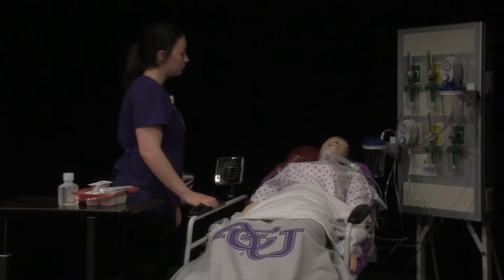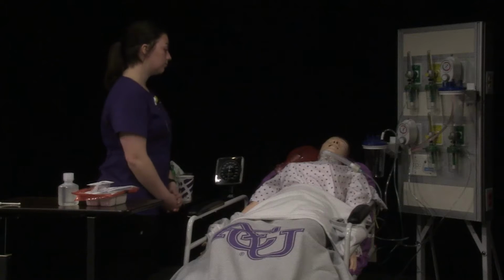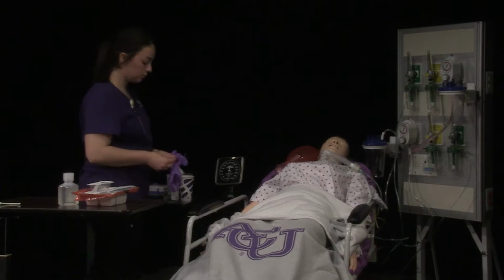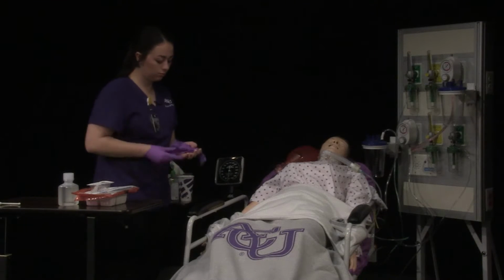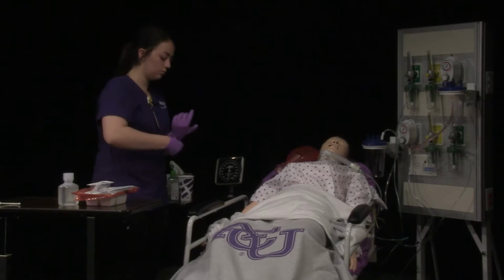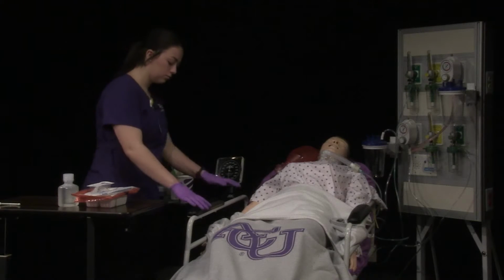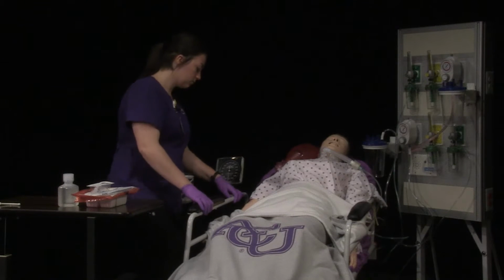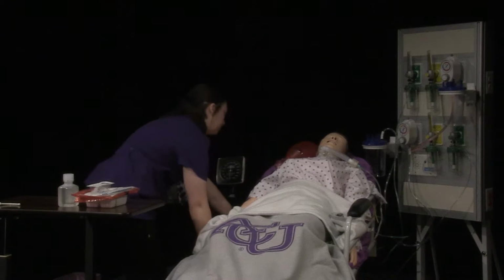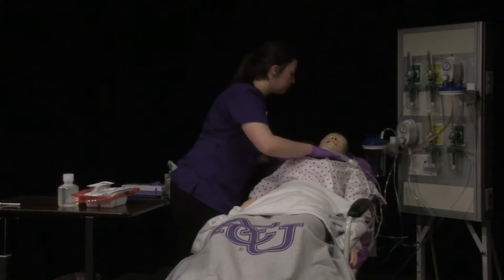Ensure that all emergency equipment is within reach, including the obturator. Don clean gloves and apply proper PPE. Raise the bed to working height and lower the side rails as appropriate and safe. Assess tracheostomy for placement and patient for respiratory status.